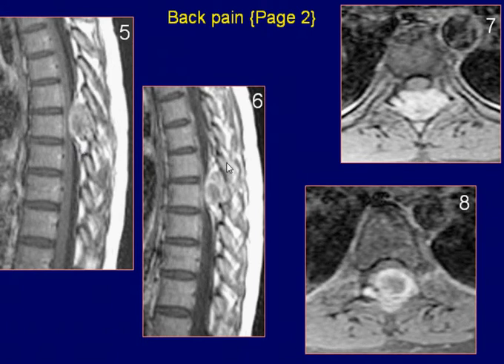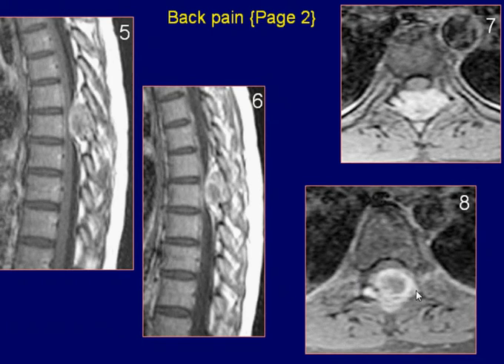Sagittal post-contrast T1-weighted images demonstrate heterogeneous enhancement of the lesion. Axial post-gadolinium fat-saturated T1-weighted images again demonstrate an enhancing lesion with a central non-enhancing area. There is involvement of the lamina and the spinous process of the thoracic vertebra by the lesion.